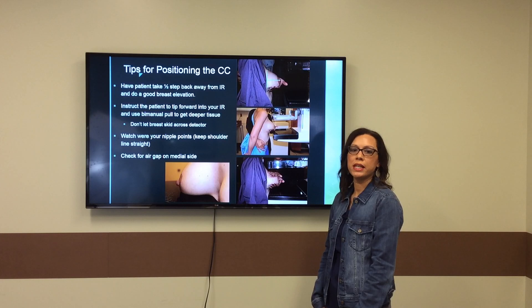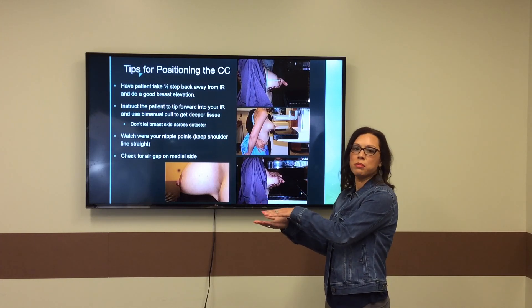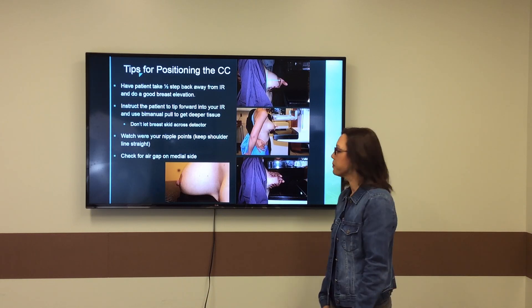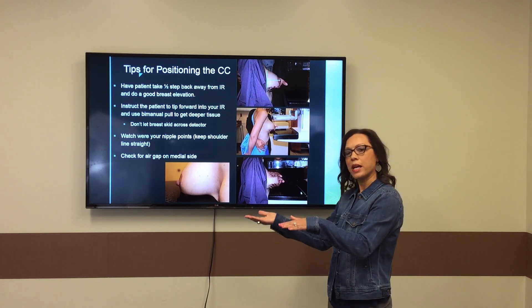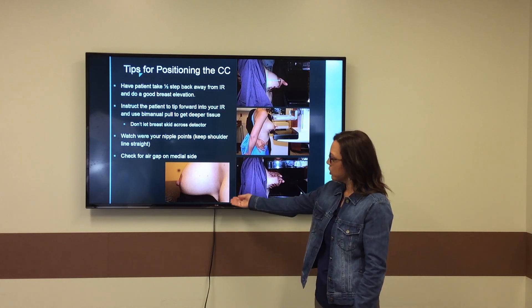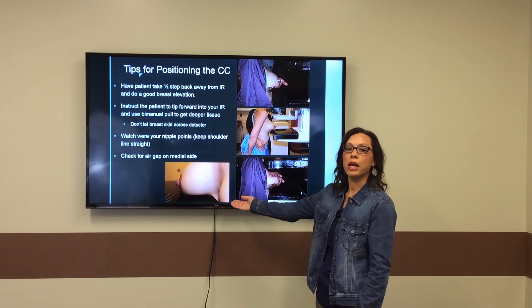When she's leaning in, use both hands to do a bimanual pull to get all the way back to those deep fibers that we need to see on the breast for the CC projection. Once you've gotten the bottom hand pulled straight out towards the nipple, anchor down with your top hand and really take a good evaluation of your medial side. Make sure there's no air gaps there.